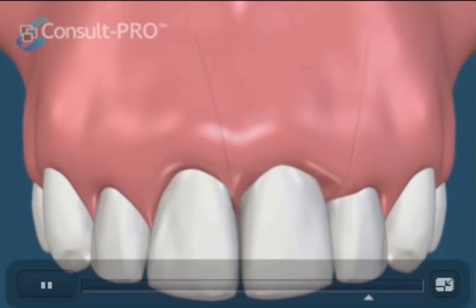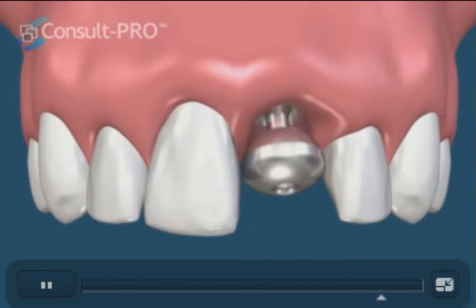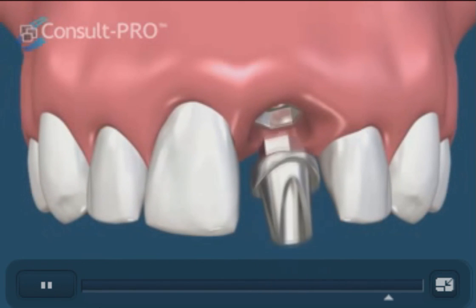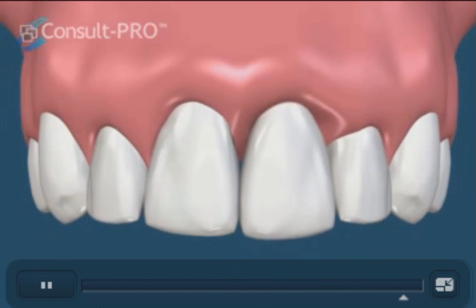With adequate time of approximately four to six months, we can then restore the implant. We remove the healing cap and an abutment is attached to the implant to give it structure, followed by a crown that will replace the top of the tooth. The gums around this tooth may not fit perfectly at first but will mold to fit the implant with time.